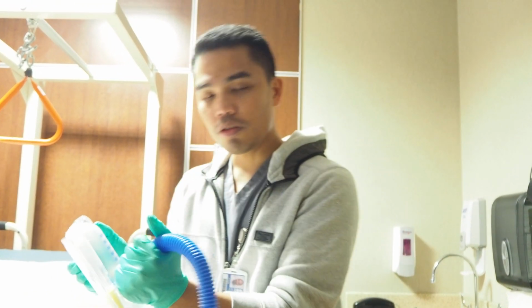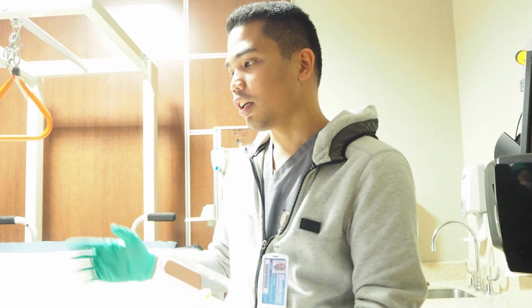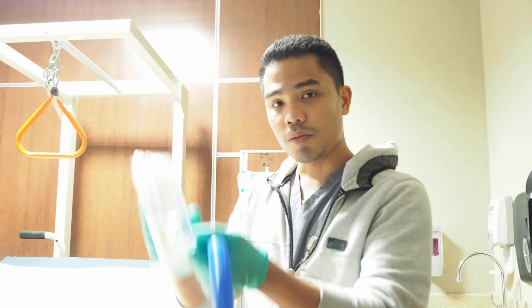So if we want to do multiple attempts, make sure we let the patient rest for a few seconds. And then if we wanted to, especially if this is the initial trial, we can start at least about 5 breaths per hour until such time we can reach 10 breaths per hour if they are able to tolerate it. After every attempt, allow the patient to cough, by the way, sorry, and then take note of its color, consistency, and amount. And then once done, remove the device.